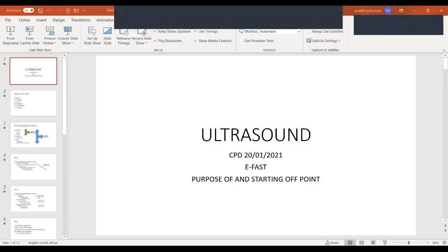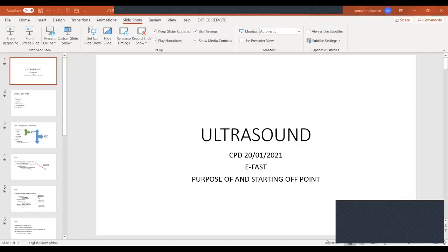All right. So this was done on the 20th of January. We're going to discuss what the purpose of eFast is and where we start, which is normally the liver.